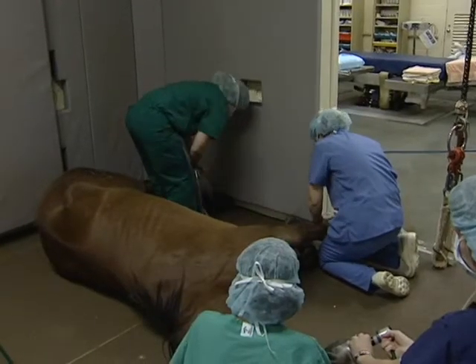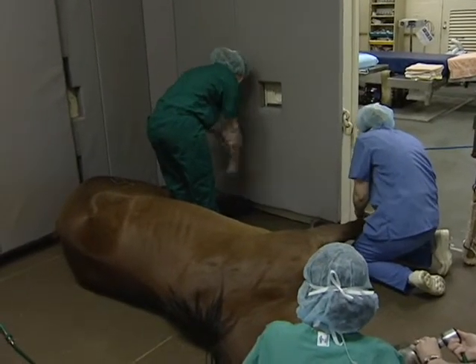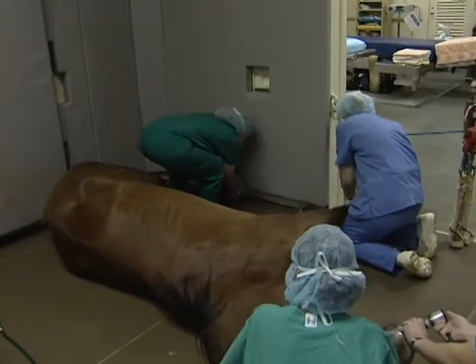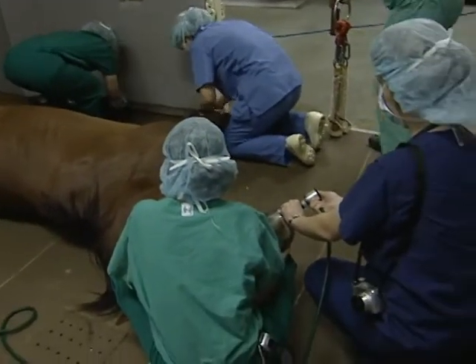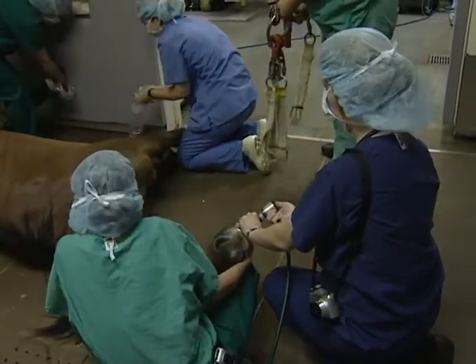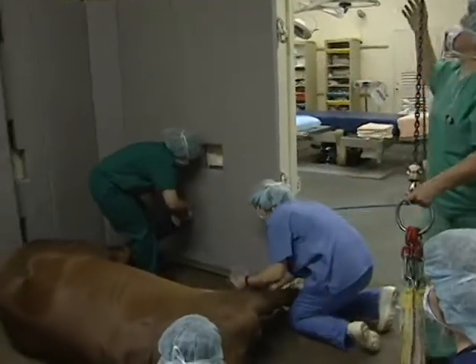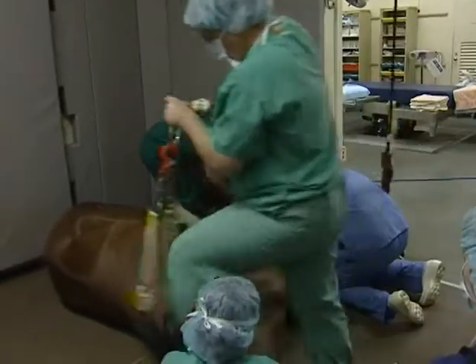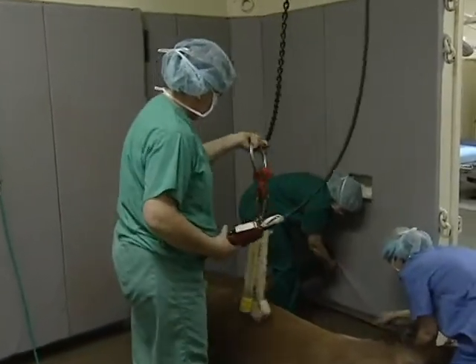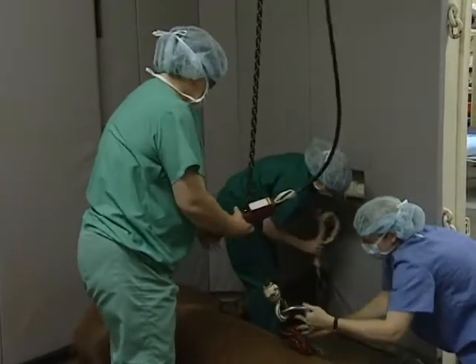What they're doing there is covering the legs of the horse with plastic sleeves to make sure that any small particles of manure or shavings that weren't washed away won't fall into the surgical area. So they're going to cover his legs, and the next thing is Dr. Adams will have hobbles placed on the horse's legs, one on each leg. They're going to bring this crane around, this hoist, and hoist the horse up, and then they'll roll him into the surgery suite and place him on the table in there.